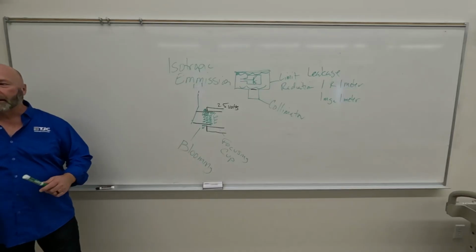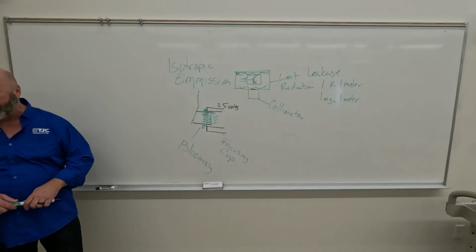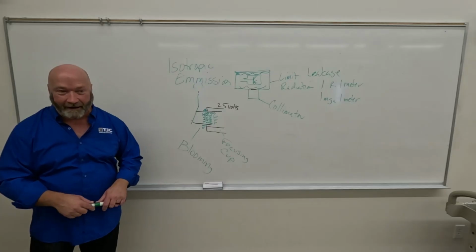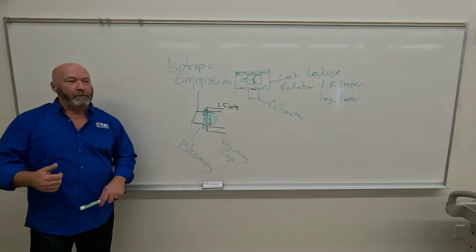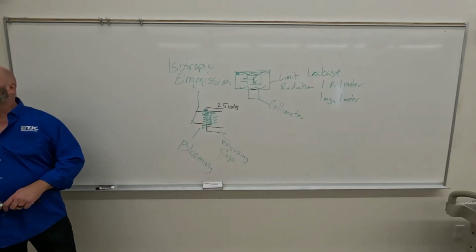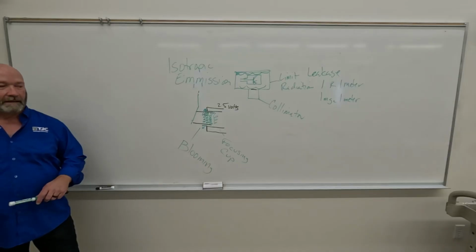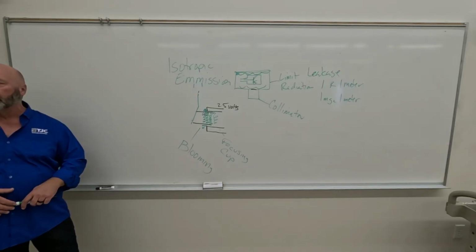So kids, they exhale forever. They go, eh. They run out of air. Right? Well, if you wait till, you missed it, right? So you have to be on that rotor button. If you're in ICU and the patient's on a vent, you have to be on that rotor button.